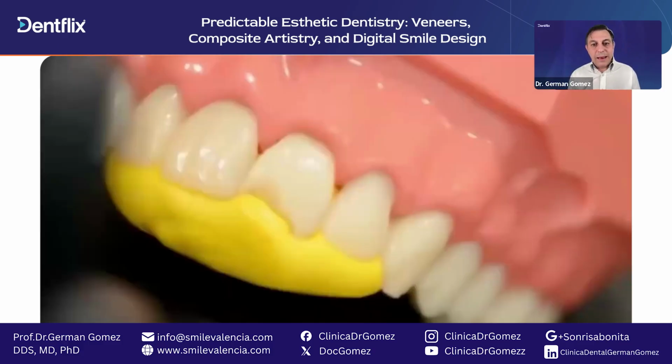Now we have to start layering from the back to the front. If we have a broken tooth, we can either use our thumb as the back wall, or we can make the back wall ourselves. How? We make a mock-up.